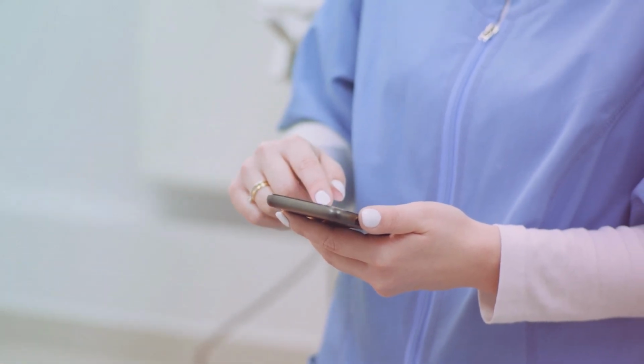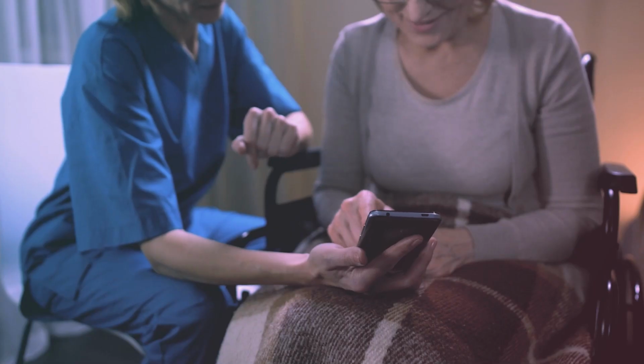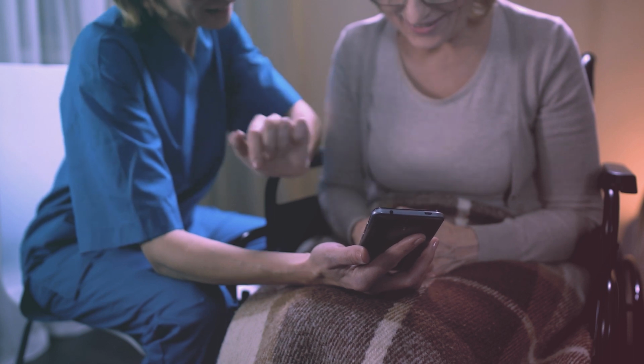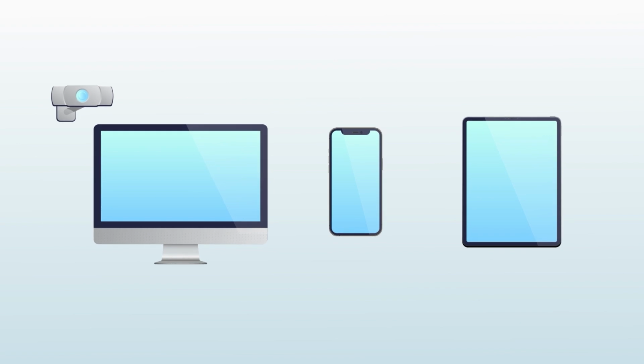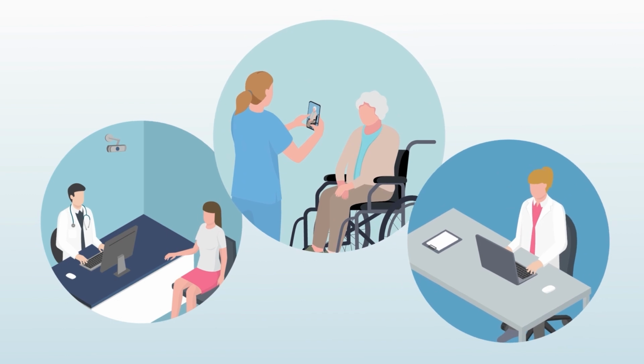Vitacam is medical software developed for healthcare professionals as well as home users under their guidance to gather, report, and review vital signs data. The system utilizes standard digital cameras such as webcams and smartphone cameras to measure a person's respiratory rate and pulse optically.